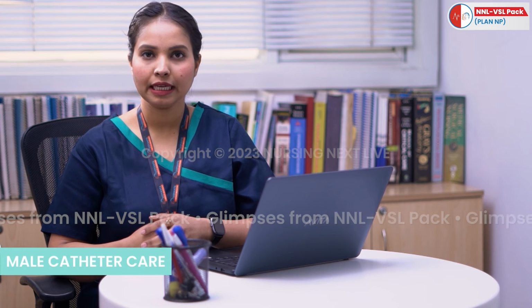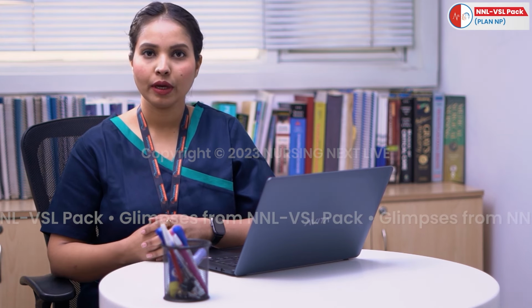In this video, a nurse will understand the various aspects of male catheter care, purposes, CAUTI bundle checklist, equipments required, steps of procedure, aftercare, and most importantly, what to do when things go wrong. In other words, common clinical errors.